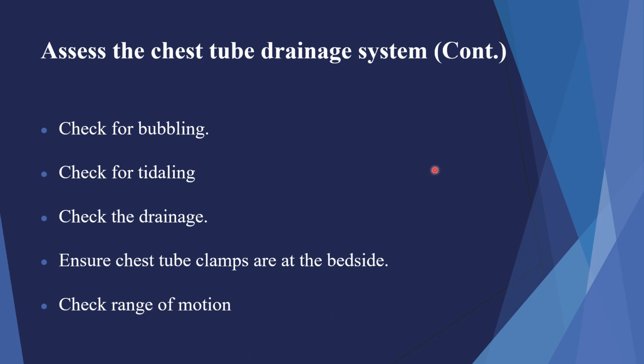All right, on our chest tube, again, check for bubbling. The bubbling that we're checking for, there's going to be two areas, and I'm going to show you a slide in the next here that's going to talk a little bit more about the bubbling. And then we'll talk about the tidaling as well.